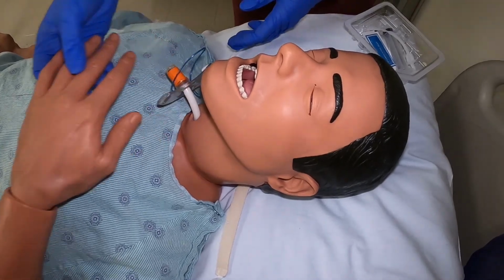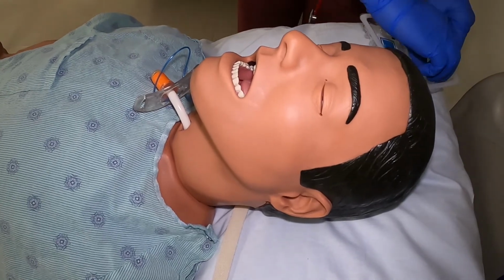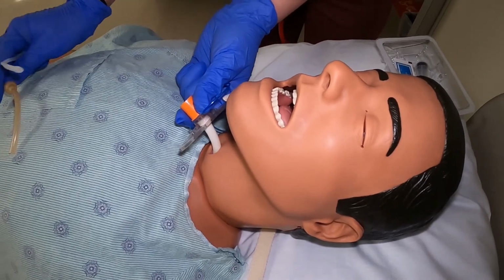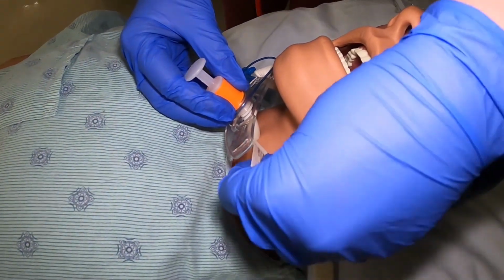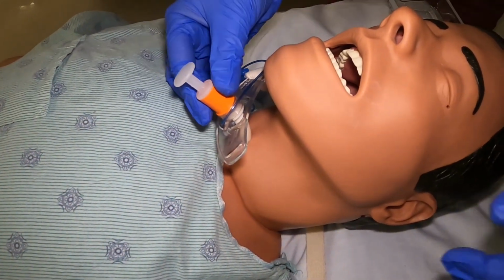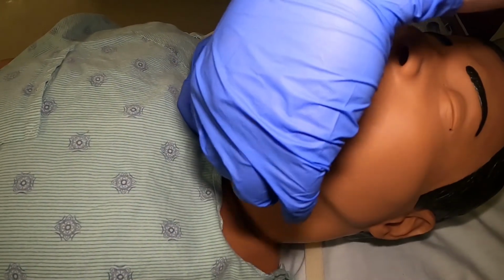We will now discuss the steps you need to take in the event of an accidental tracheostomy dislodgement. Position the patient for attempted tracheostomy reinsertion by placing the head of bed down and the head in sniffing position. Obtain the obturator from the head of bed and remove the inner cannula from the dislodged trach and place the obturator into the trach tube. Lubricate the trach tube and or stoma site with water-soluble lubricant and stand at the head of the bed looking down towards the feet for proper angle for insertion.